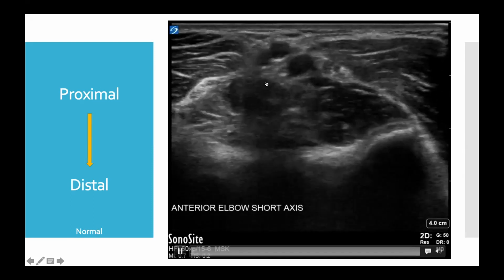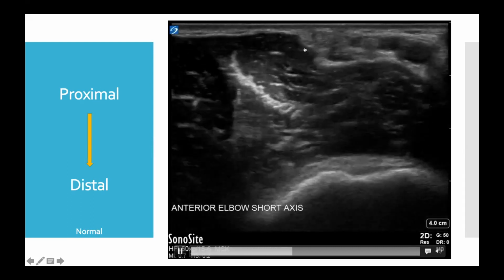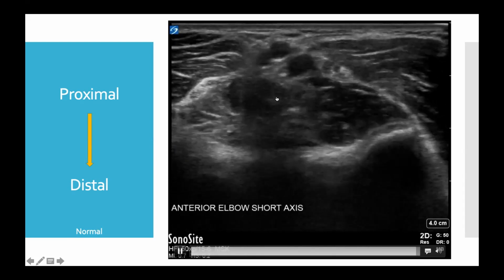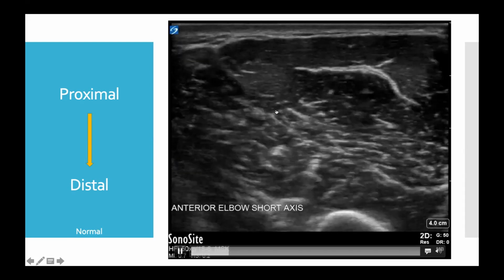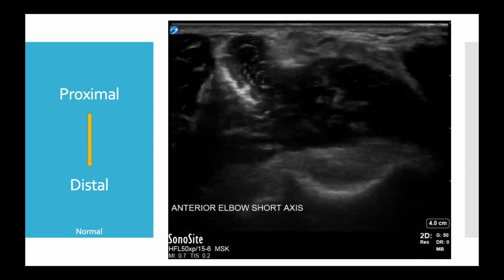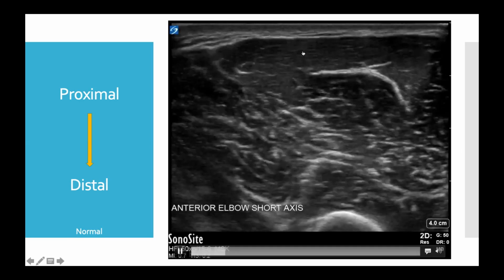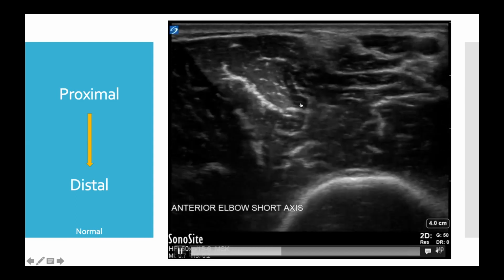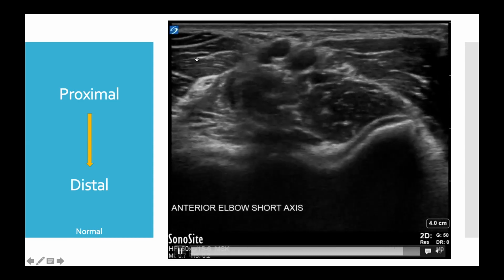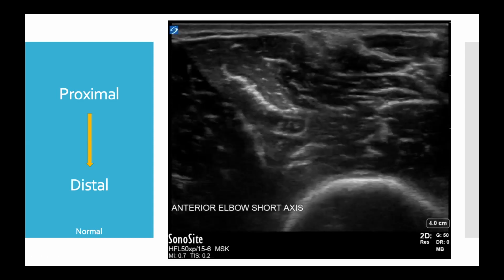Now, the problem is, as we get closer to the home base, the biceps tendon really becomes subject to anisotropy as it dives deep. That's the main concern with trying to evaluate it for its full breadth in short axis. But that's the main focus of this clip, looking at it in short axis. We can also see the brachialis muscle come in, as well as the brachioradialis, pronator teres, and the rest of home base as we glide more distally.